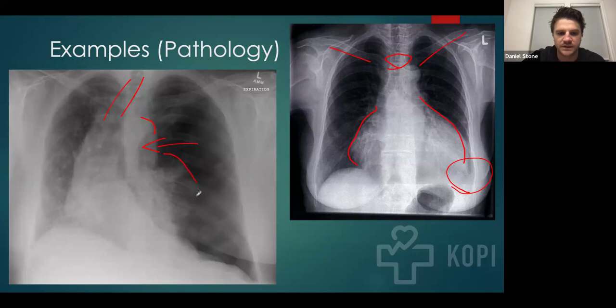You can tell the pleura is outlined here, and then you can tell over here that there's a diaphragmatic abnormality known as the deep sulcus sign, which just basically means that there's tension pushing downward as well as across. It's pushing down on the diaphragm.